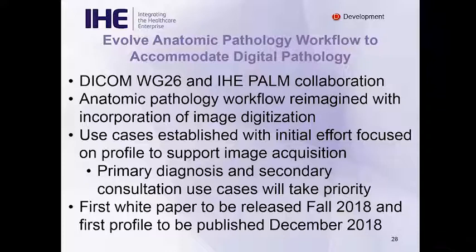And we're trying to think about anatomic pathology workflow digitization, but also trying to reimagine it, rethink it in a setting where pathology laboratories have a significant quantity of digital assets to maintain, and what the benefits might be, and how best to mitigate costs and increase the efficiency of a digital pathology workflow.